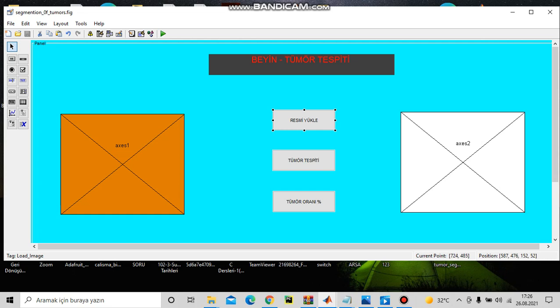First one will load our images, and the second one will detect our tumor in brain, and the third one will show us the percentage of the brain in soft tissue, the percentage of the tumor in soft tissue.